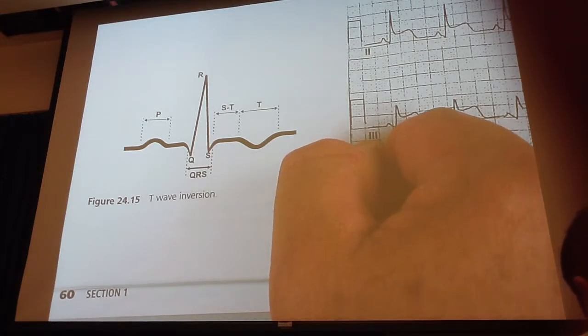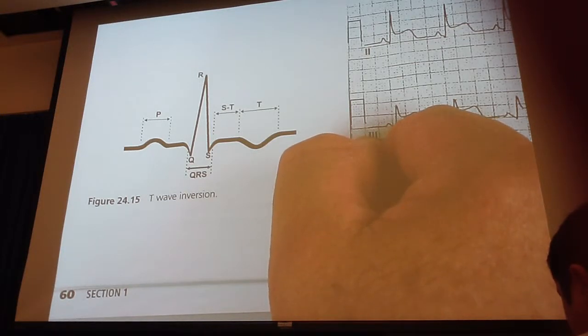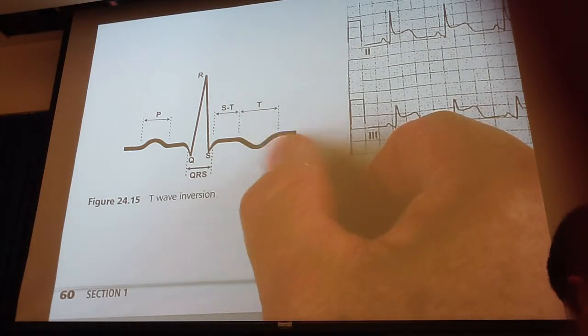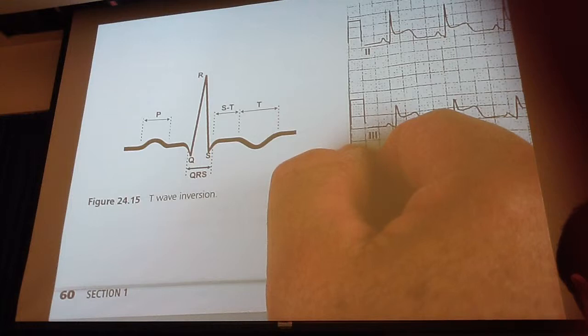Remember those EKG books that you had? I want to take a little look at those. Actually, this chapter here is very good. It's a short, detailed explanation of EKG. Okay, this is an old infarct. I thought those were like U waves. A U wave, a little U wave after the T.